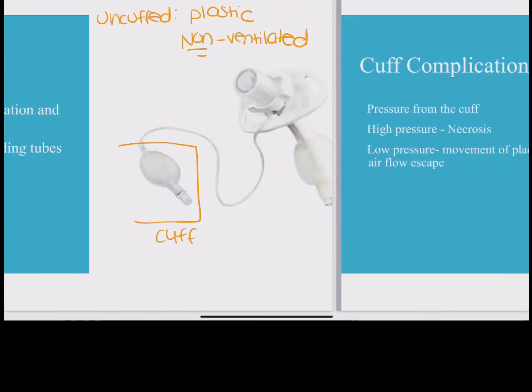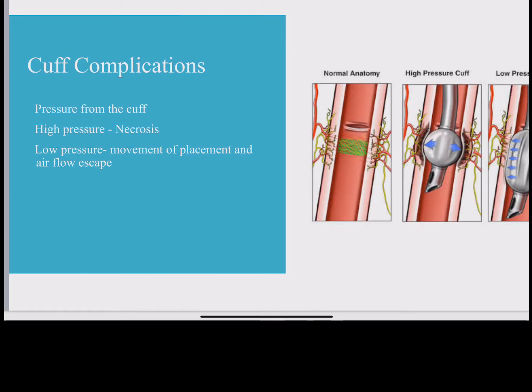Complications with the cuff, well, it depends on the pressure of the cuff that is regulated by the pilot balloon. So high pressure can lead to necrosis. Low pressure allows the movement of the trach and airflow to escape. So really, here is your trach.